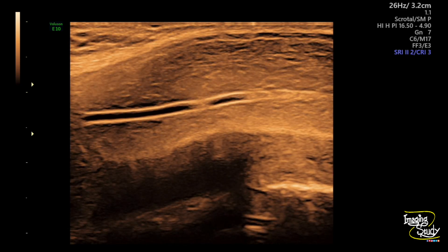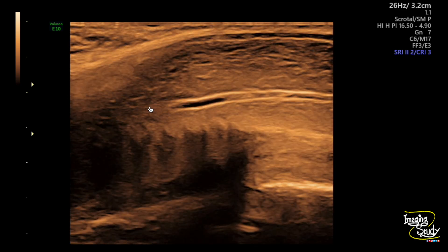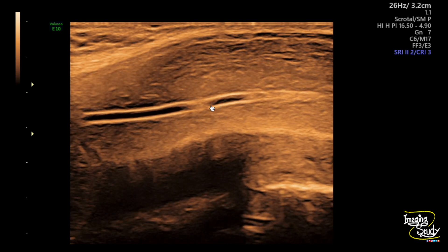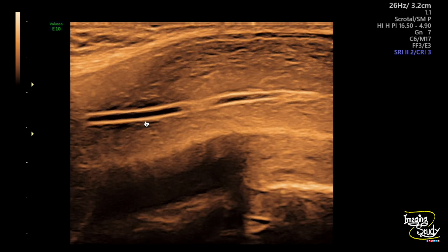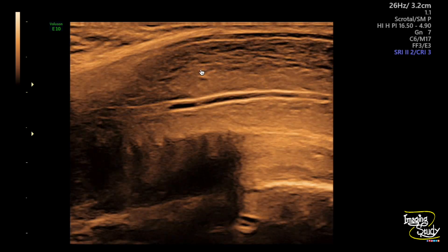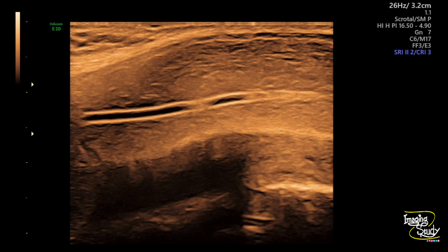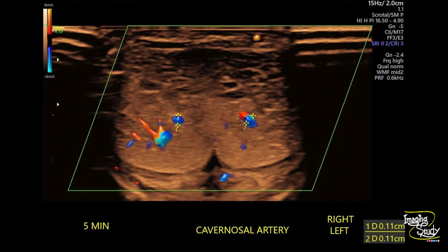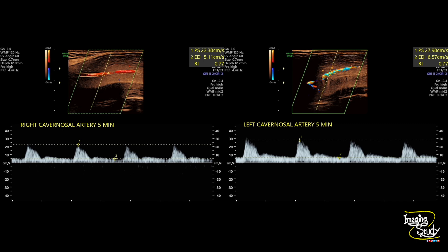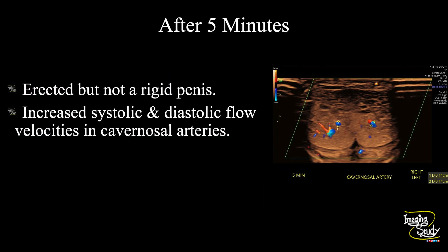Just 5 minutes after injection the penis became erected. You can see the cavernosal artery is quite dilated — you can even see pulsation without any Doppler. The sinusoids are filled with blood with anechoic areas visible within. The vessels are now around 1 mm in diameter with good flow. Peak systolic velocity was around 20 to 30 cm/s and diastolic flow is increasing. You can see notches here. However, after 5 minutes the penis was erected but not rigid at all.